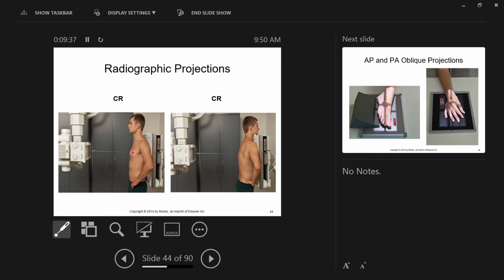You're still going to see the lungs, you're still going to see the heart, you're still going to see the hilum of the heart and lungs. You are still going to see, in children, the outline of a gland called the thymus gland in the chest. You're going to see all of the same structures, but how they're presented to you might change, right? The projection you use changes the view you get on different body parts, right? As Francisco correctly said, the heart will appear larger in the AP image than the PA, okay?